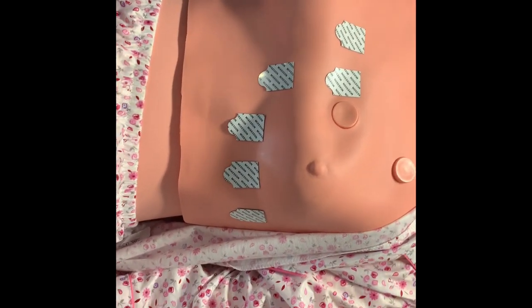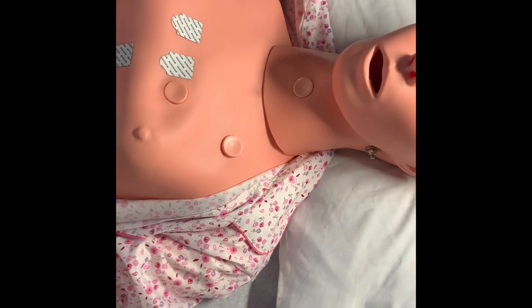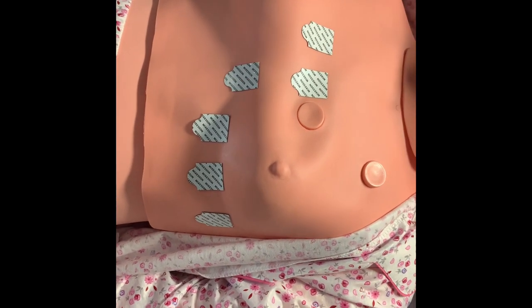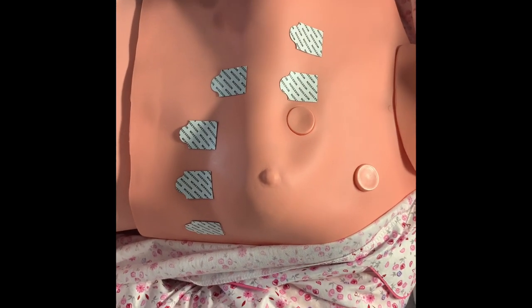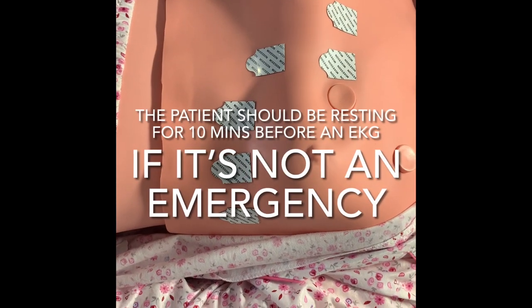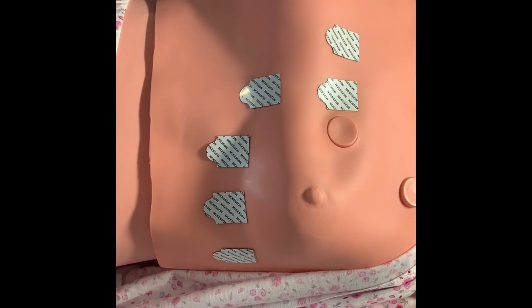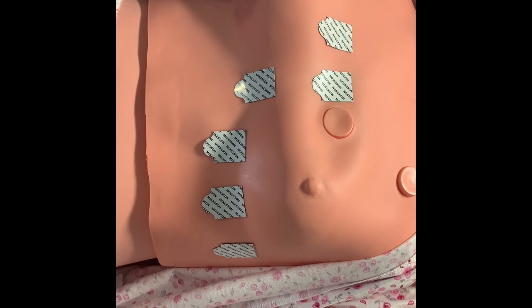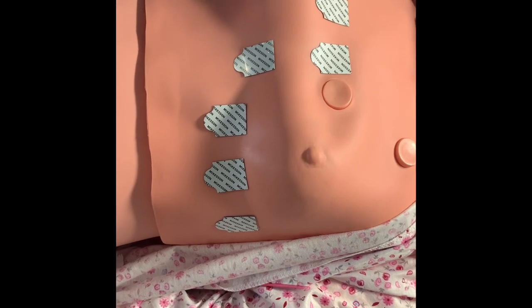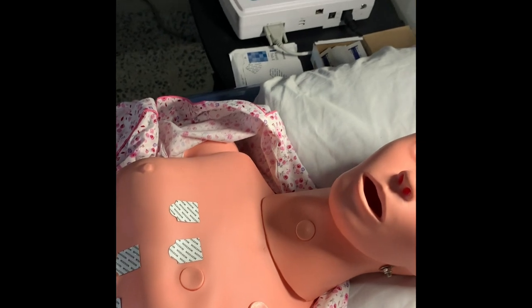Returning to the 12-lead EKG — you want to make sure the patient is calm. You don't want to be having a full-blown conversation with the patient. Make sure the patient is not cold, because if they're cold they're going to be moving around. You want the patient to be as still as possible, nice and calm. If the patient has any cell phones or electronic devices, try to move them away from the patient and the EKG machine so you won't get any artifacts.